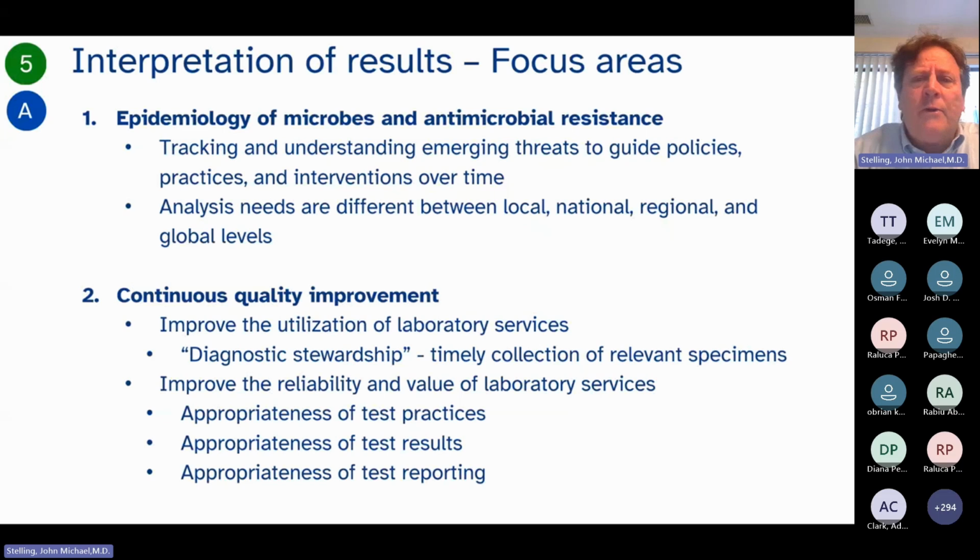So as I mentioned earlier, why do we do analyses? We do analyses with 2 objectives. One is to study and act on the epidemiology of changing microbial populations and resistance. And there are different needs at the local, national, regional, and global levels.